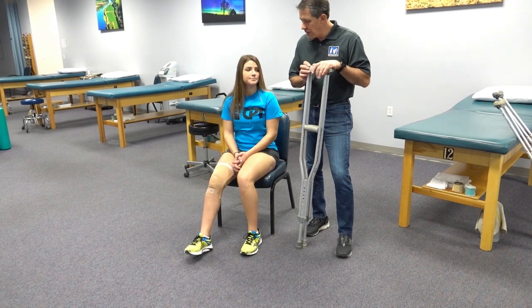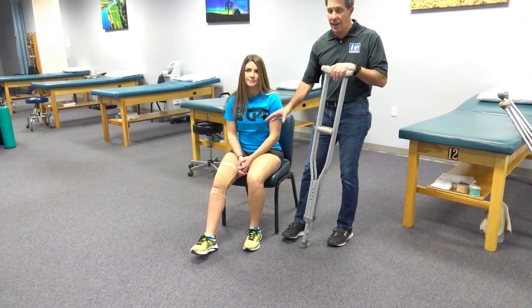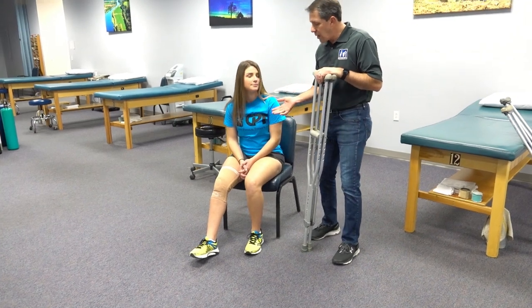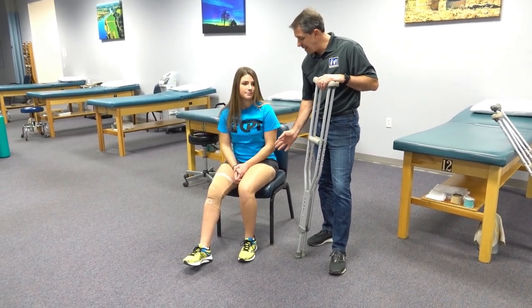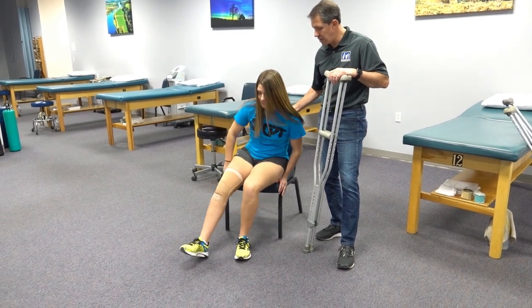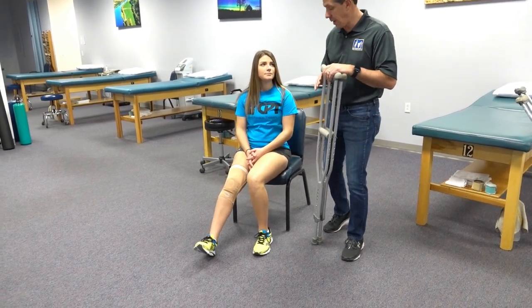One of the things you need to realize here is that we put a brace on the side just to indicate that is our injured leg. When you do get ready to get out of a chair, it's important that you scoot yourself ahead a little bit so you bring yourself closer to the edge, so you're not too far back in the chair — because it's very hard to get yourself forward over your foot to get yourself upright.